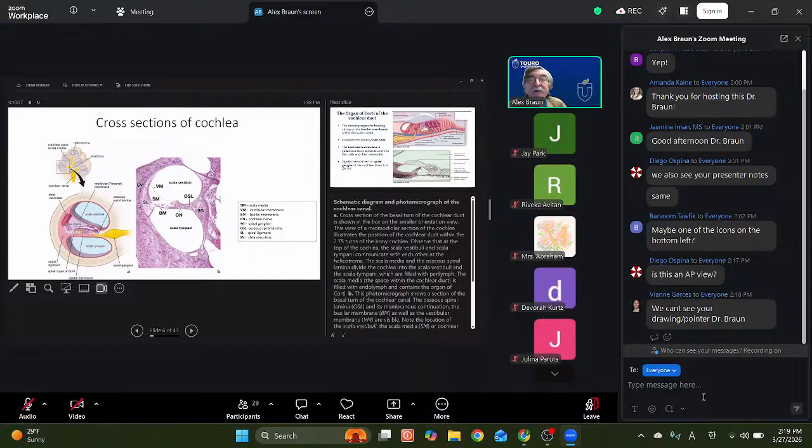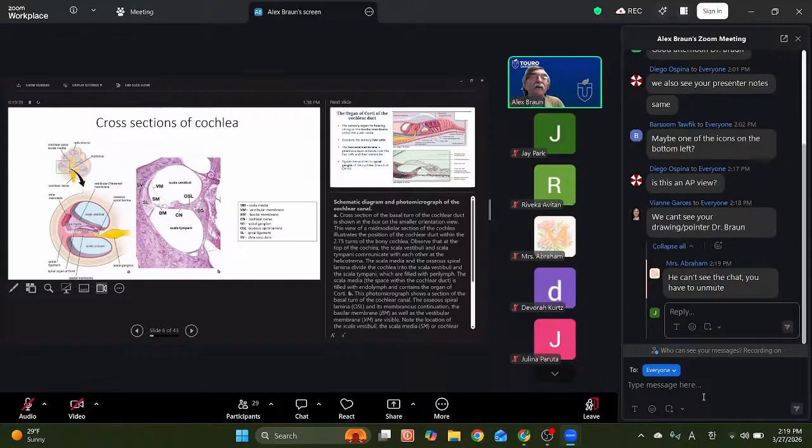So if you were to transect the cochlea, you would see multiple turns of the cochlea within that transection. So here we see basal turns within the cochlea. Here we see the apical turn of the cochlea, and here we see the middle turn of the cochlea, all together forming the 2 3/4 turns of the cochlea.